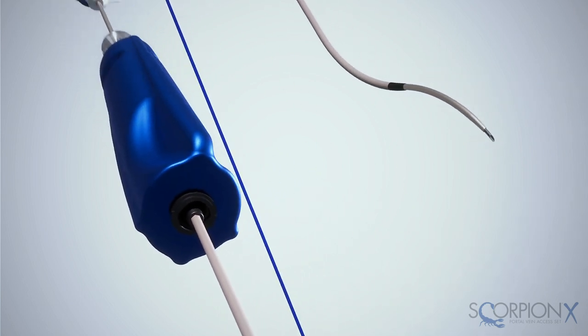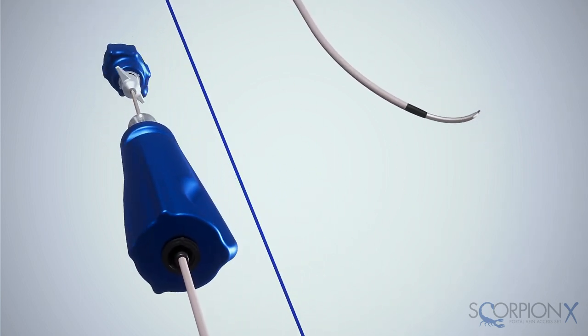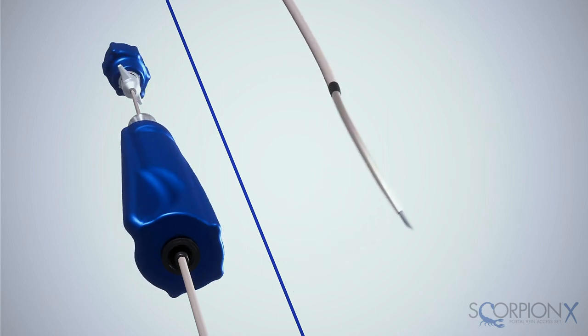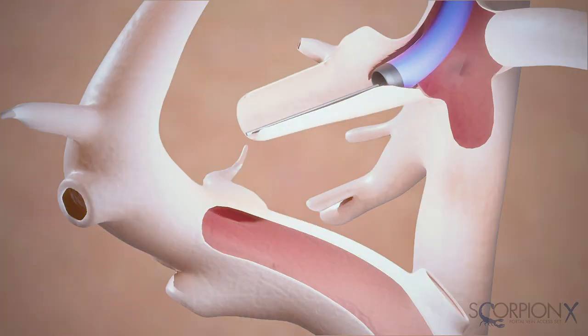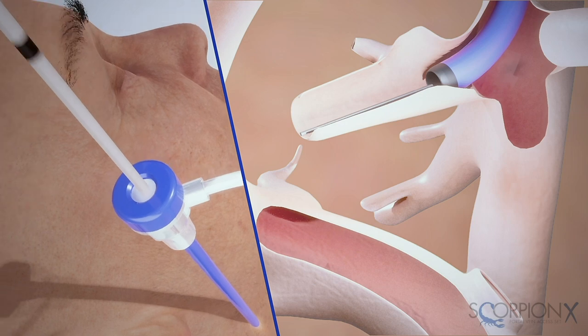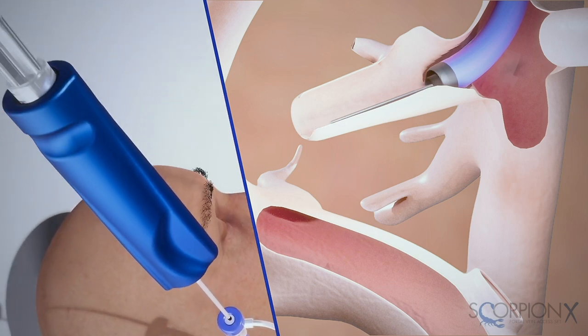The needle and stiffening cannula each include innovative curves that interact independently from one another to provide increased control, dexterity, and efficiency during the procedure. Insert the ScorpionX's stiffening cannula through the 10 French introducer and remove the guide wire.